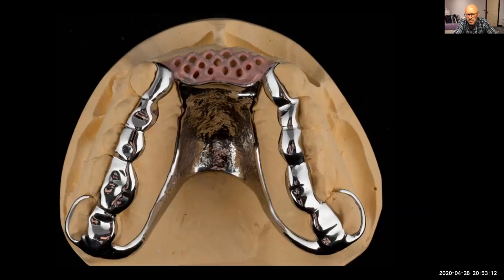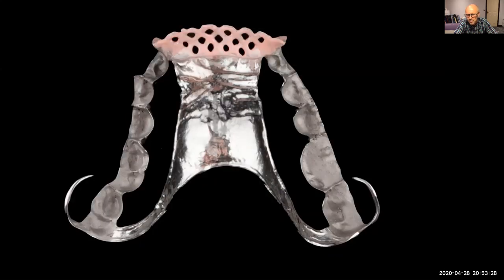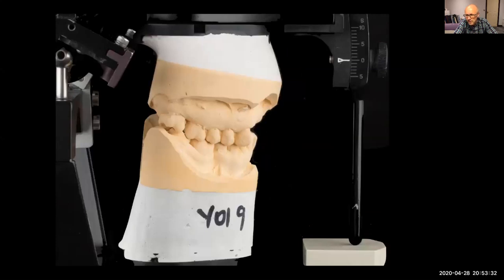And also a lot of work has to go into these to make them. So this is the protective splint here. Superb. Scandinavian design. You can get TPs in between. Works beautifully. So robust. And it just fits lovely. So here we've got the mounted models. These are the working cast, the working upper cast. That's the pin set at 0.